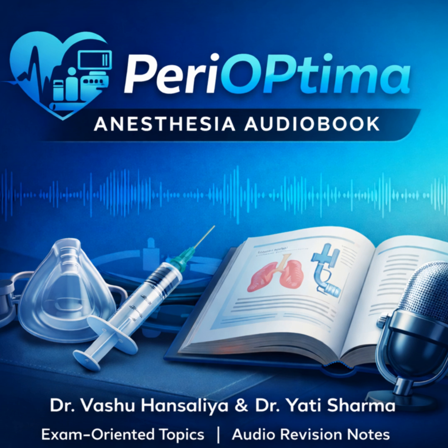Okay, so once we're prepared, let's detail the steps. What's the generic SGA insertion method? Typically, the patient is supine. You might need a slight jaw lift to ensure a clear pathway. The technique involves holding the device with your dominant hand and directing the tip against the hard palate, making sure the mask aperture is facing the patient's toes. Okay. You advance it into the oropharynx, often with a gentle twisting motion to get around the base of the tongue. You continue advancing until you feel a definitive resistance. This means the tip is seated against the upper esophageal sphincter.